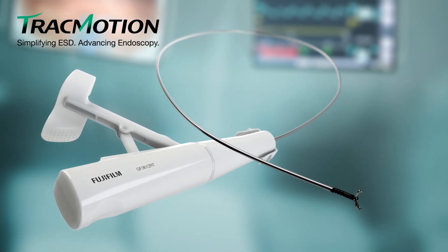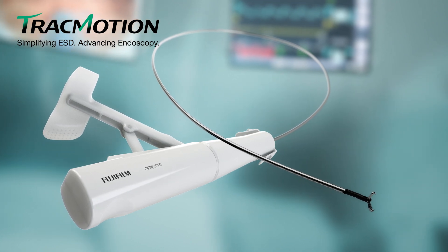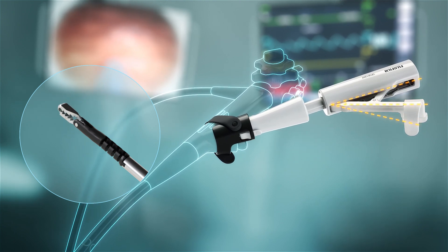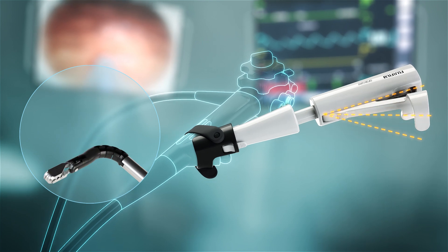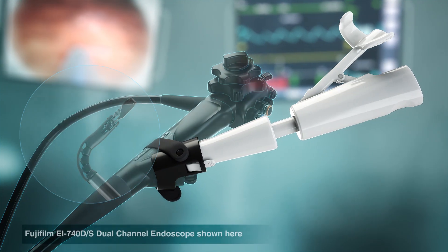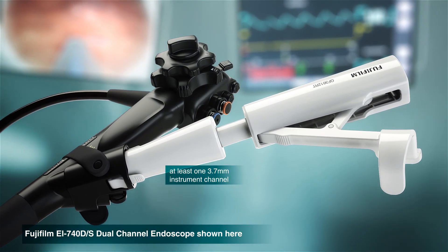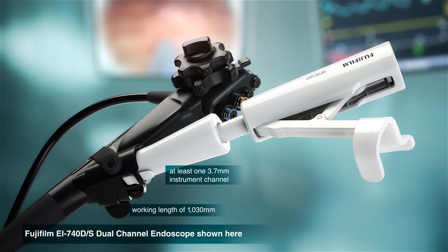Fujifilm presents the Track Motion Retraction Device for Endoscopic Submucosal Dissection, or ESD. 360-degree movement of track motion enables control and easy grasping and re-grasping of large lesions during ESD, simplifying the process and potentially reducing procedure time. The Track Motion Retraction Device is compatible with dual-channel endoscopes that have at least one 3.7 mm or larger instrument channel and a working length of 1,030 mm.